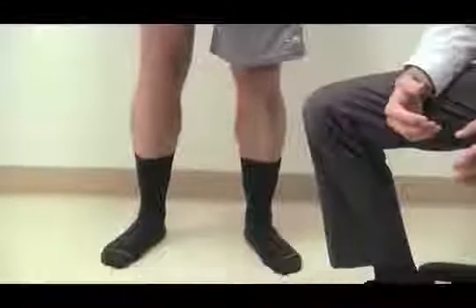Step one is getting your patient into a natural weight-bearing position. Have them stand with their shoulders back, their feet shoulder width apart, and with their knees slightly bent. Notice the patient looks comfortable in a normal position.